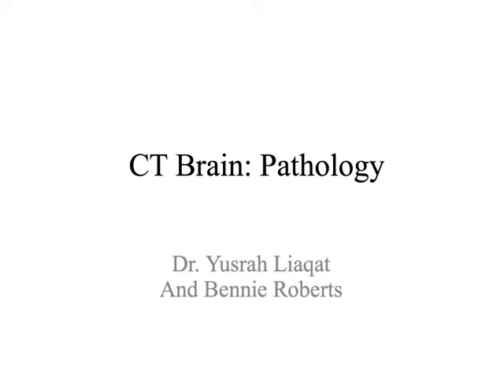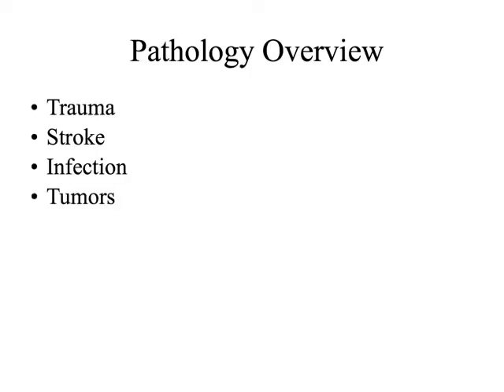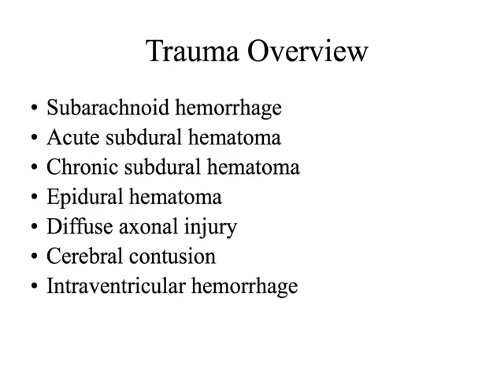Okay, let's spend some time talking about brain pathology. So just in terms of an overview, we're going to be talking about trauma, stroke, infection, and tumors. Most of our time is going to be spent on stroke.